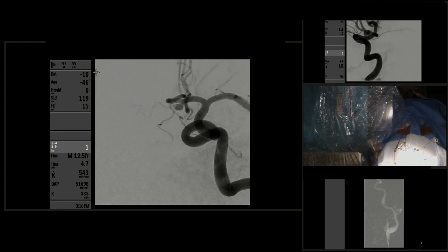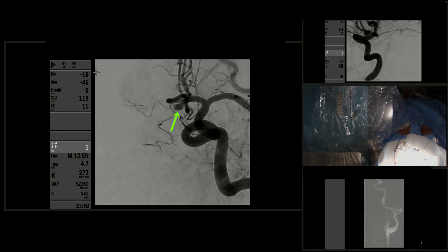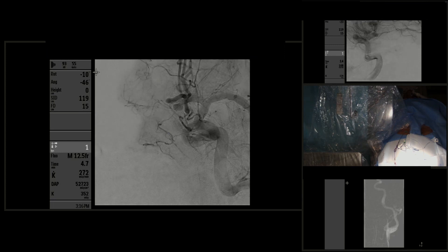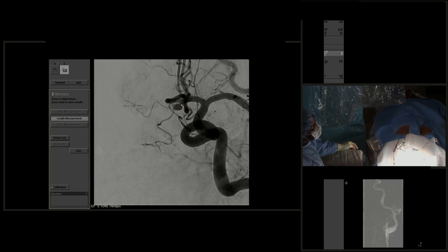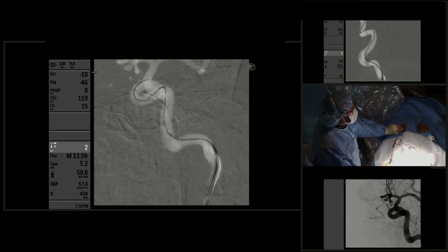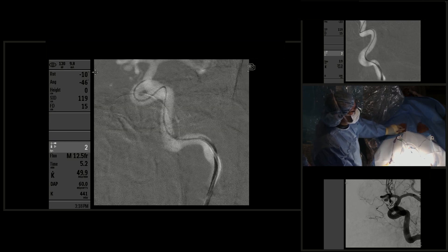The patient was taken to angiogram and we can see the opacification of the aneurysm of the anterior communicating complex. After identifying the aneurysm, we measured it to be able to appropriately size the coil that we're going to be using for embolization.